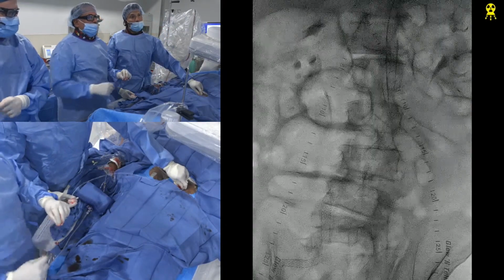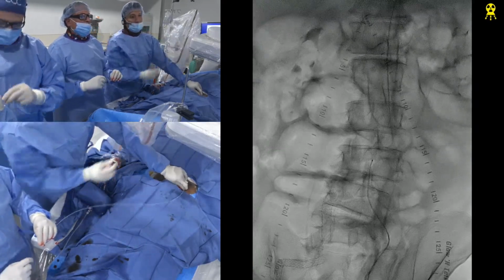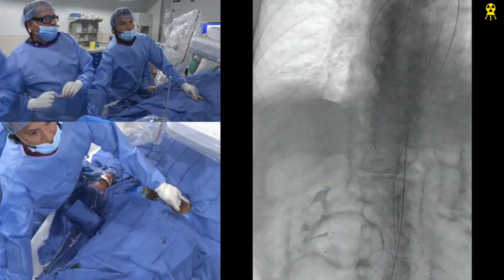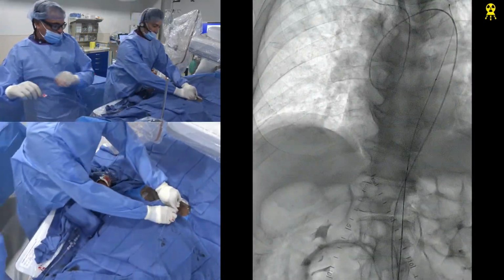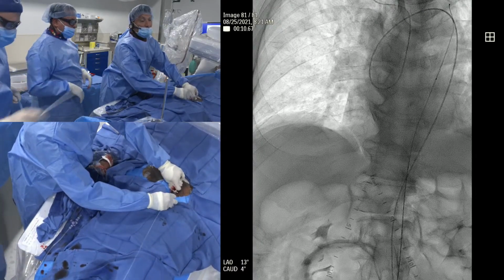Yeah, sometimes the preparation takes a little time. I think this case is mainly about how to prepare yourself to finish it quickly, right? Good. All right, 25 centimeter sheath, gang. Right here? Right there. It's right there. Okay, good. You made a nick, Karthik?